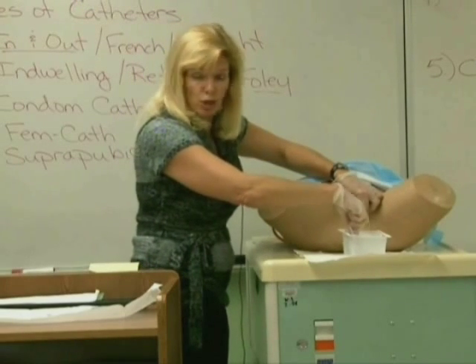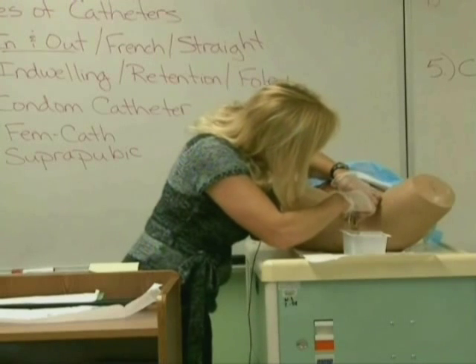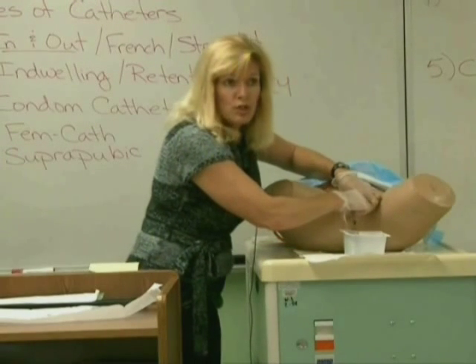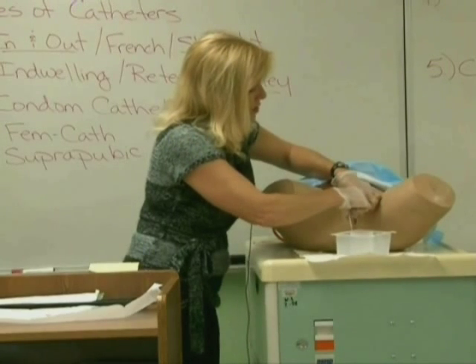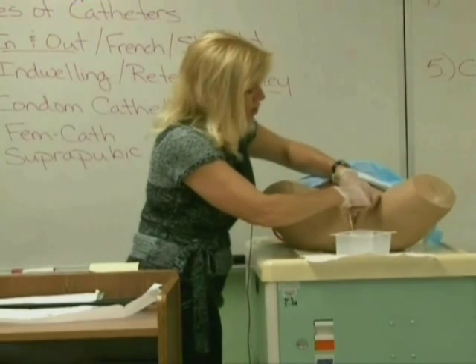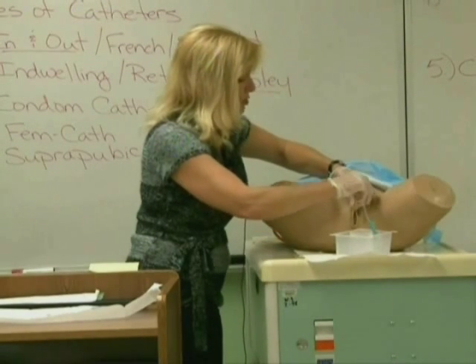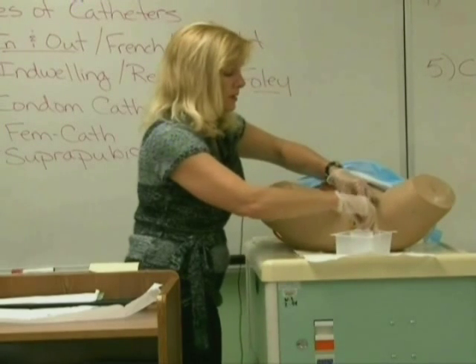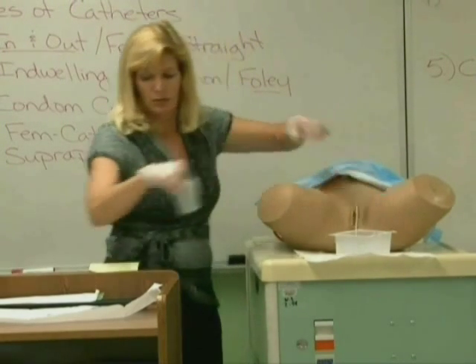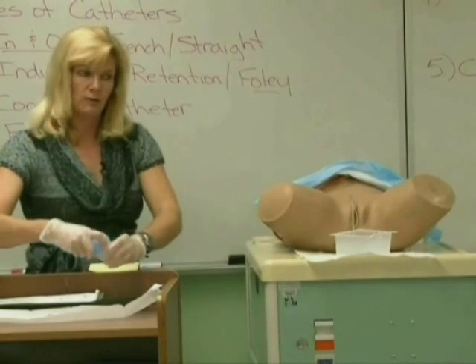When you go to insert for the female, it will be a much shorter insertion — about two to three inches before you start seeing urine coming out. You're inserting — in, in, in — you see urine. You're not going to place the catheter any farther in. Use your other hand to pinch off, fill up your cup, let the rest drain, and go through the same procedure of labeling your cup and taking care of your patient.